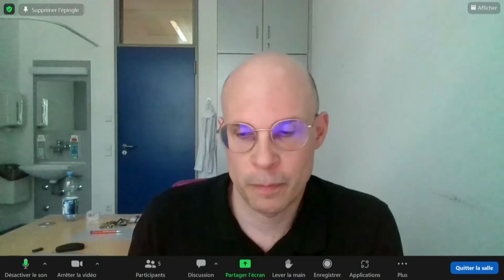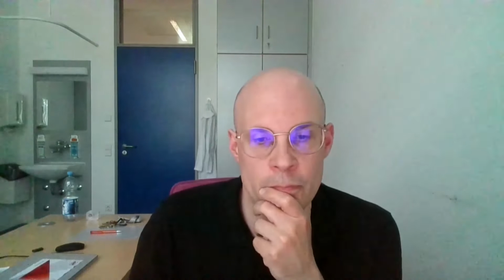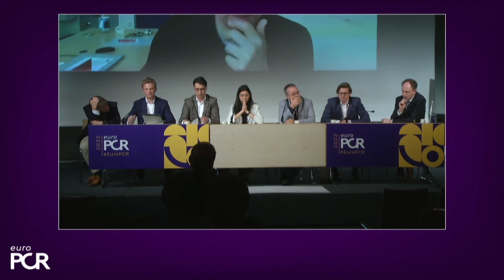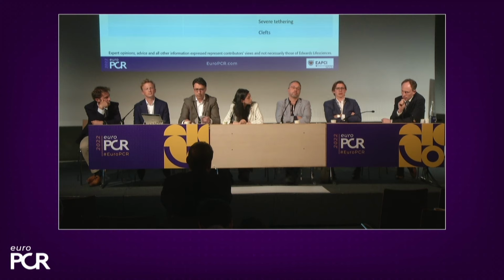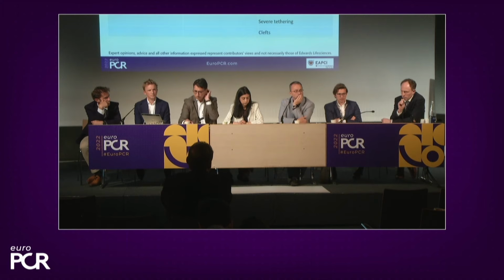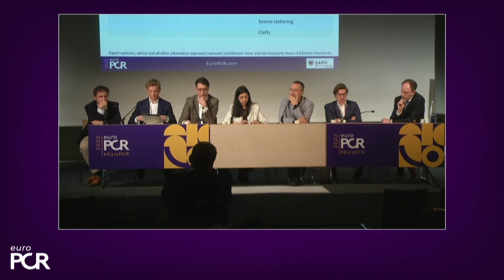So thank you, Philipp, for showing this very excellent case. And I think it nicely showed that with two Pascal Ace devices, we can effectively reduce the mobility in this large flail case. You put the first Pascal Ace in a more lateral position. Normally, we always discuss this with regard to imaging, that we might start at the medial position. What was your strategy here? Could you also have started with the prolapse in the medial position, or was the better visibility of this Pascal Ace device a reason that gave you more freedom to use this strategy? What is your opinion on that?